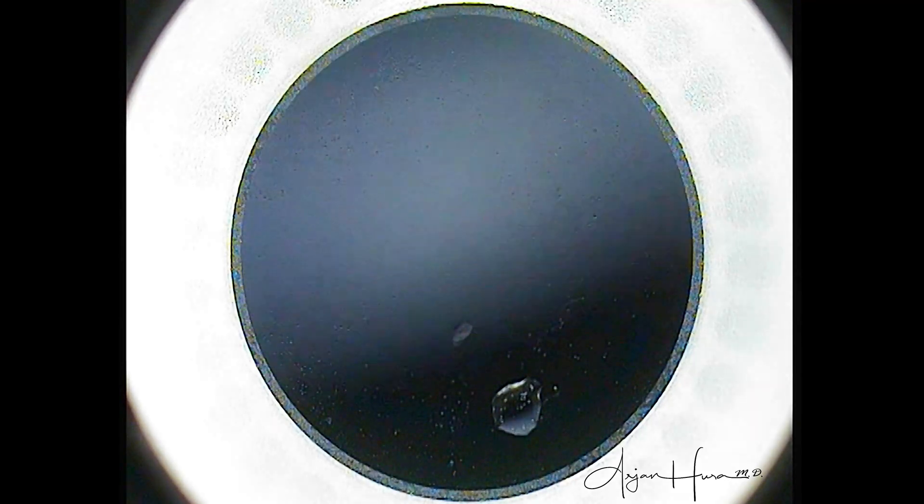That's why it's really important that the patient's cornea be as pristine as possible before docking with the laser. If anything looks off before starting, release suction, irrigate the cornea, and clean or replace the suction cone. Lots of black artifact portends a sticky dissection, so consider fixating the eye.